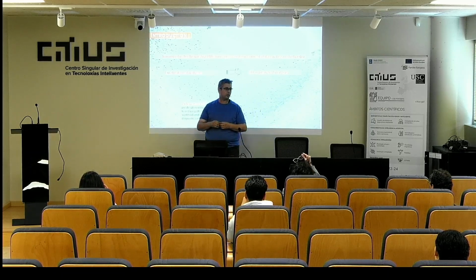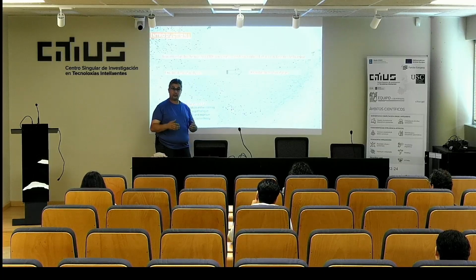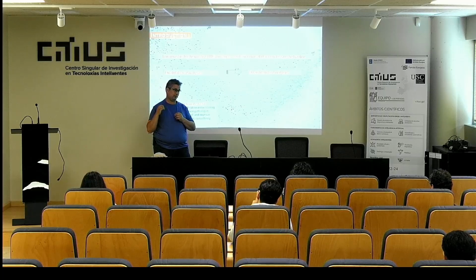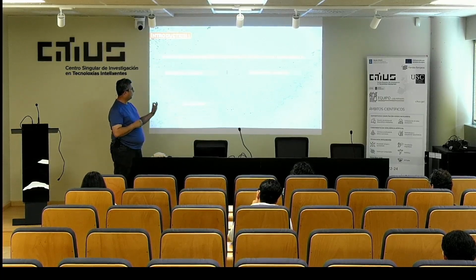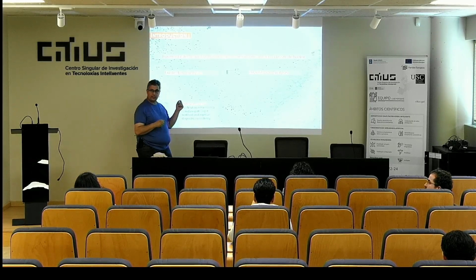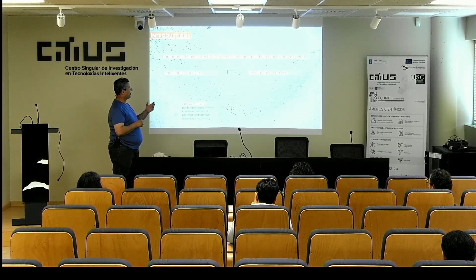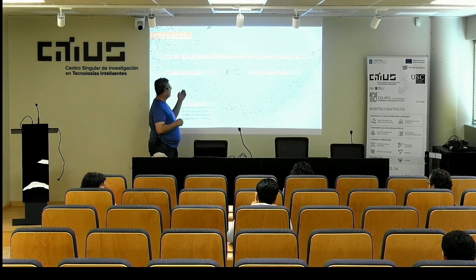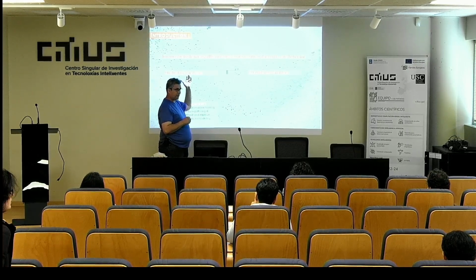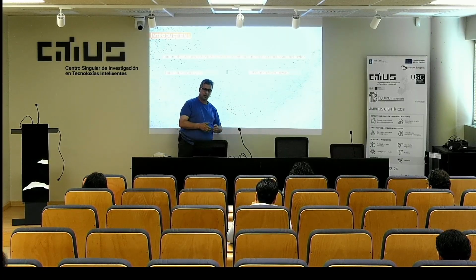So we need to move to a quantitative analysis to accurately count and classify cells of mouth tissue for cancer of leukoplakia with various degrees of dysplasia, especially for biomarkers like Ki67. Already, the immunohistochemical image contains critical tissue behavior, so the solution for our problem is to move from the qualitative analysis to quantitative analysis to make the decision.